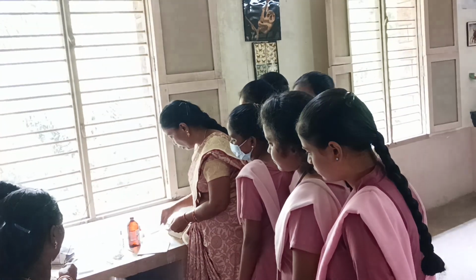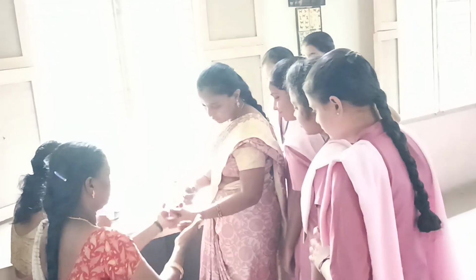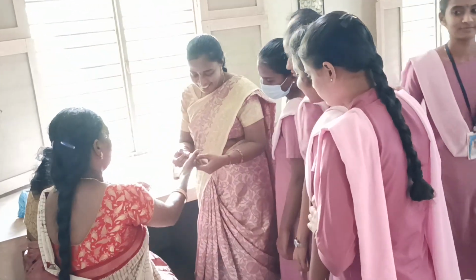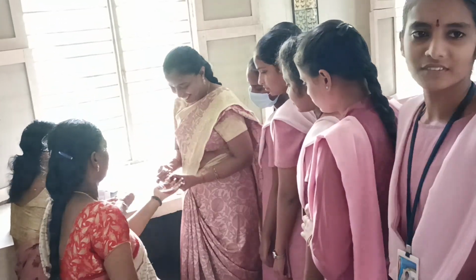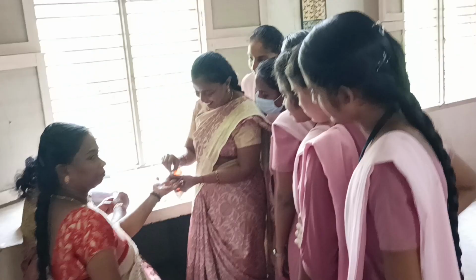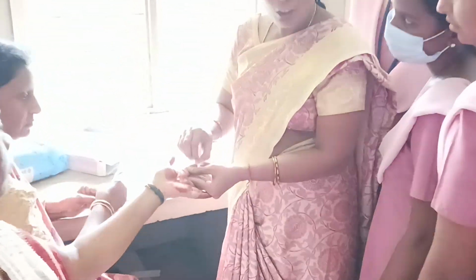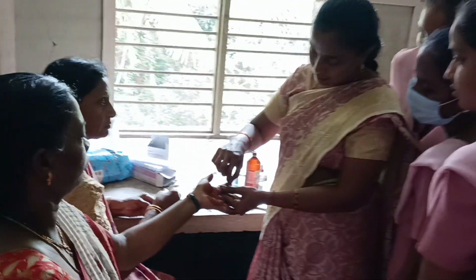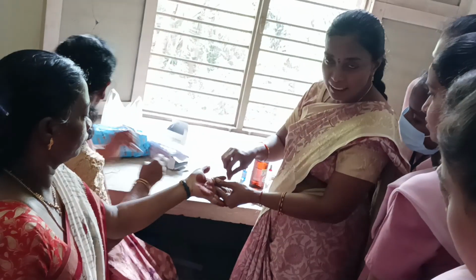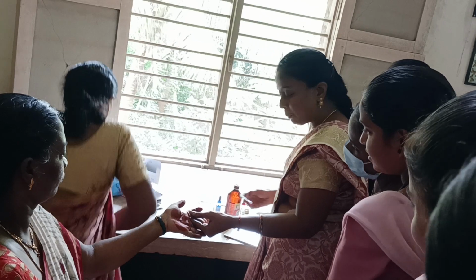Now what we will do, we will clean the finger. As you can see, madam has kept some mehendi, but still we are cleaning it because madam might have applied some powder. Without cleaning, the result will not be adequate.